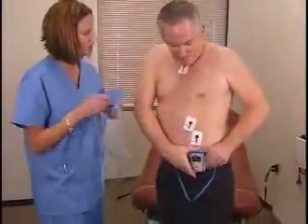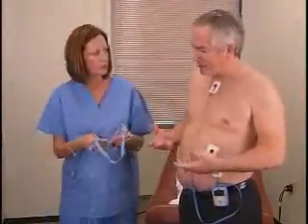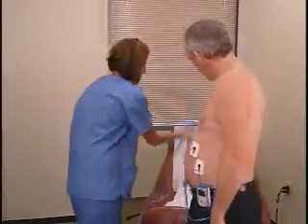Have the patient clip the recorder on their belt or waistband. A disposable Holter pouch is also available that will hold the recorder. Have the patient route and secure any excess patient cable before leaving the office.